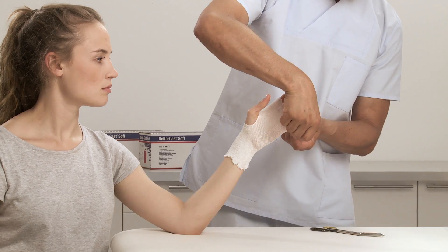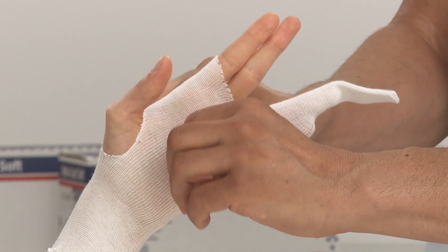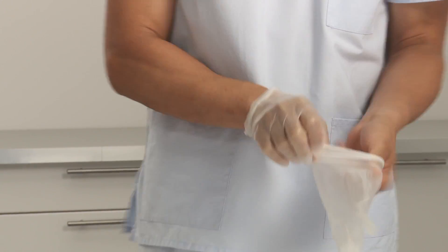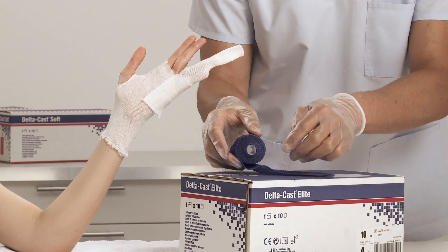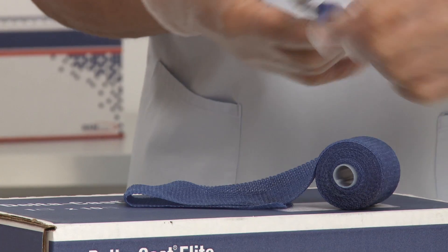If the patient has prominent bony areas, extra padding may be required. Put on protective gloves before applying cast tape. To prepare an optional reinforcement strip with a rigid cast tape, measure the length from wrist to the top of the ring finger, layer twice, cut, and then put aside.